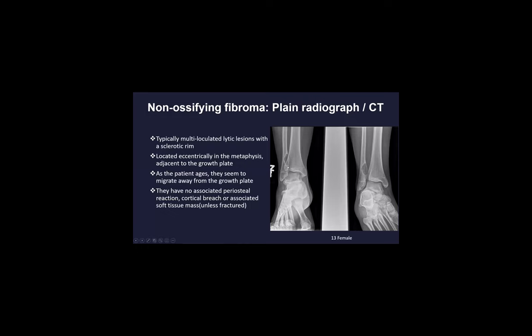Here's a typical example on the distal fibula. You can see that it's a medial lesion, it's lytic, and cortex is intact, and we have sclerotic margins, and we do not have any associated fracture, at least in this case. It was a 13-year-old female patient.